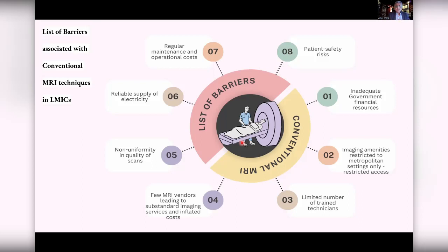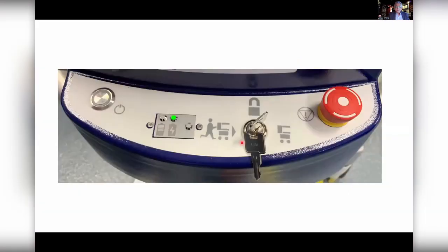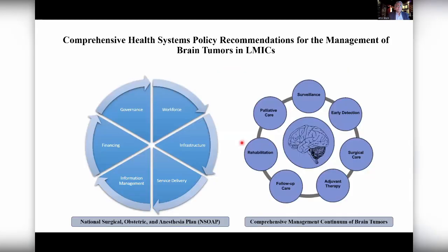cost is going to come down, and this will be the way to deal with MRIs for brain tumor management, global neuro-oncology, and LMICs. Portable machines like these are going to make the difference. The interface of this machine is so simple, and the image that is collected is pushed onto the cloud, and experts like Eddie and other people can look at it and comment on it.